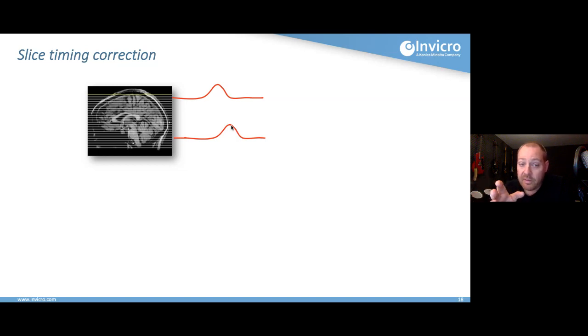That shift in the timing is just an artifact of the way that you've acquired the data, because you started at the top and finished at the bottom. So everything at the bottom is kind of shifted relative to everything at the top.